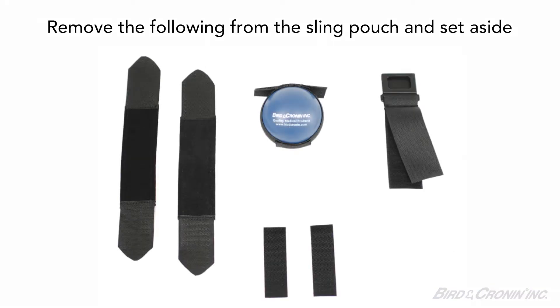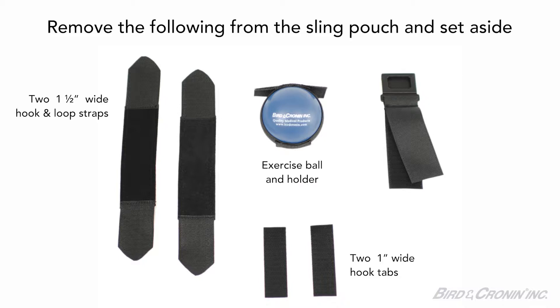Remove the following items from the sling pouch and set aside: two 1.5 inch wide hook and loop straps, two 1 inch wide hook tabs, the exercise ball and holder, and the Y connector.